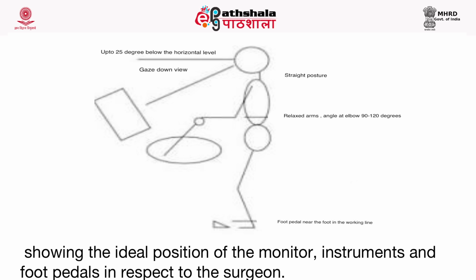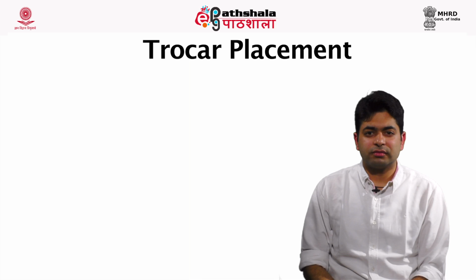Now here is a diagram where we are showing the same principles that we talked about in the last slide, that the surgeon is standing comfortably with a straight spine, straight head, with the angle at the elbow of 90 to 120 degrees, forearm in a slightly descending plane, and the foot pedal near the surgeon's feet in a straight line.